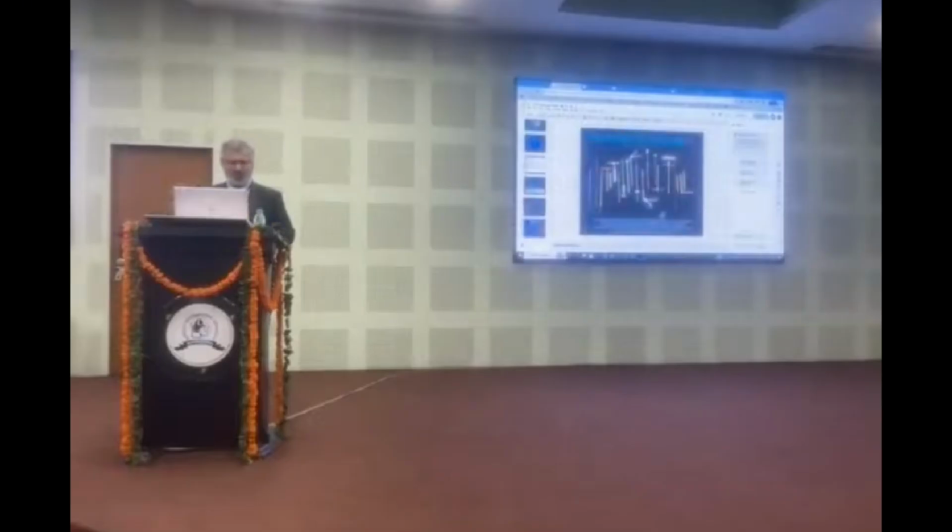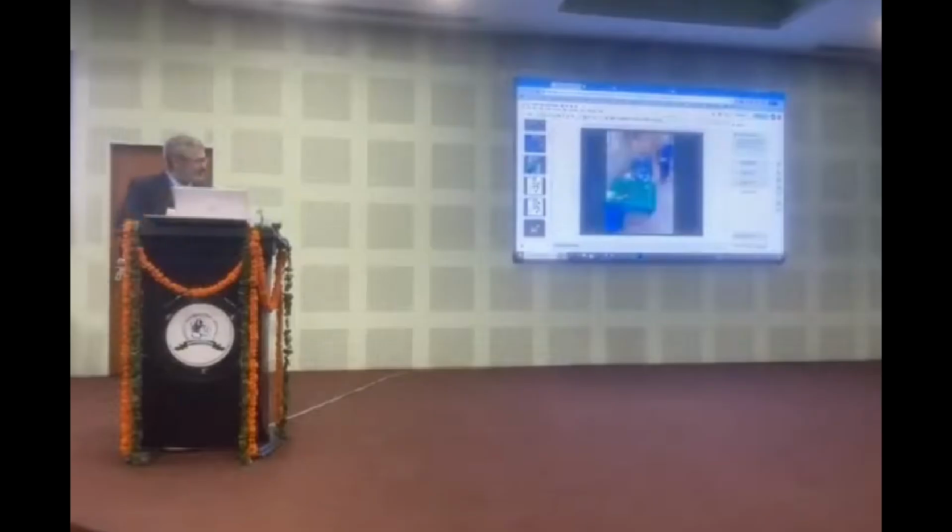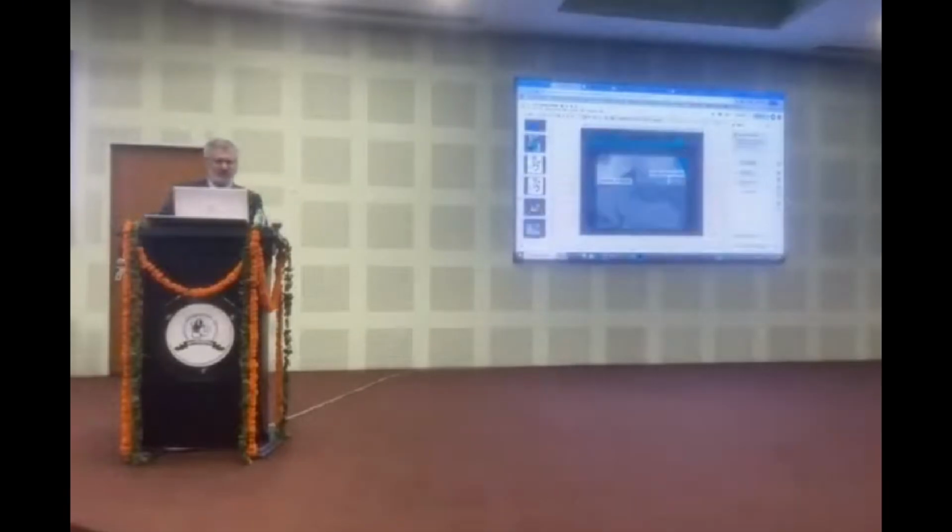This is the field in the wall. And I'm not going to talk about the setup because we will see that later. Now, I want you to see that this is all you need: the front table, the back table, and that's for critical instrumentation. For people to understand, in a regular surgery you have like 4 or 5 of these tables, sometimes double deckers, to have all the instrumentation. So it's a very simplified procedure. Now, let's watch this animation here.